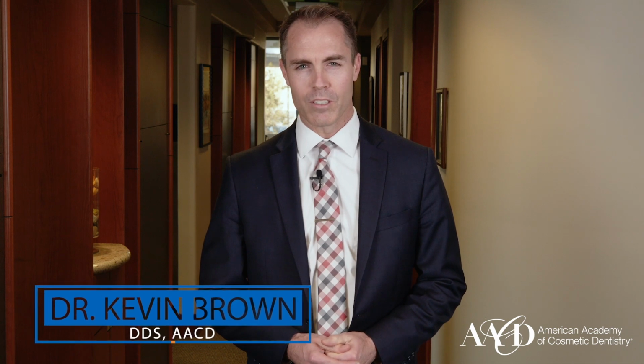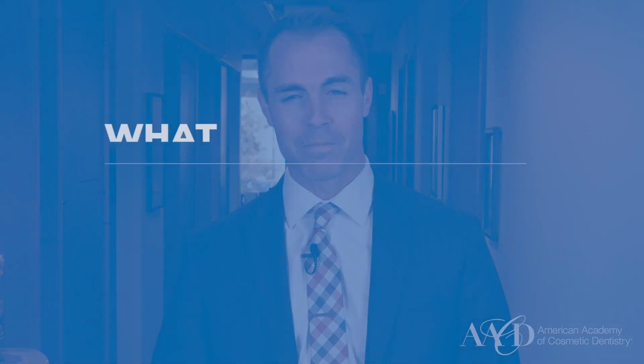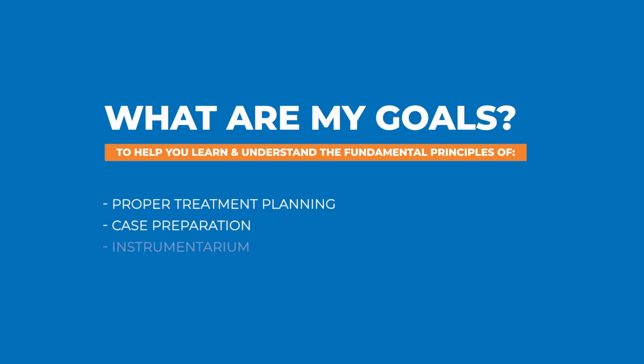Welcome to this course on the AACD Virtual Campus, where we will be showing a live patient demonstrating direct composite veneers. I handpicked this case because I felt it represents a good example of what is one of the most challenging parts for the accreditation criteria for dentists, the dreaded case type 5, 6 or more direct composite veneers. My goal is to help you learn and understand the fundamental principles of proper treatment planning, case preparation, instrumentarium, layering techniques, and polishing that will lead to predictable and lasting results for your patients.